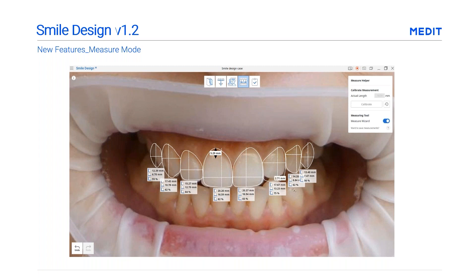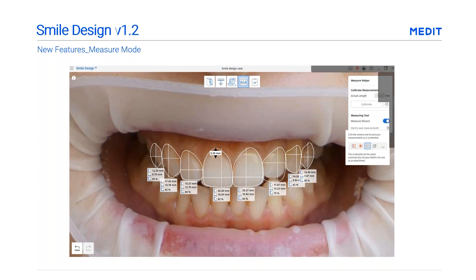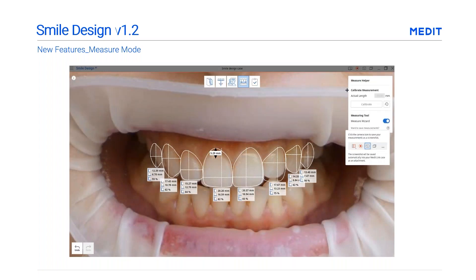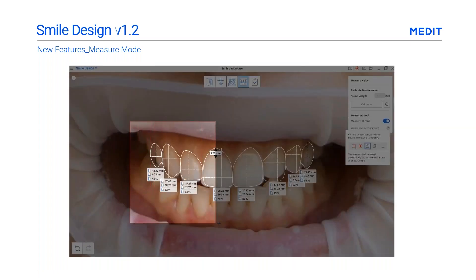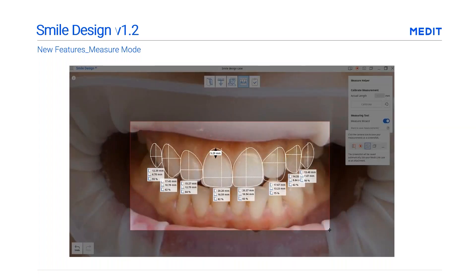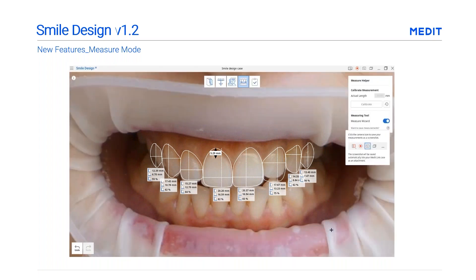To save the measurement results, click the camera icon to save your measurement as a screenshot. This screenshot will be automatically saved in your Medit Link case as an attachment.